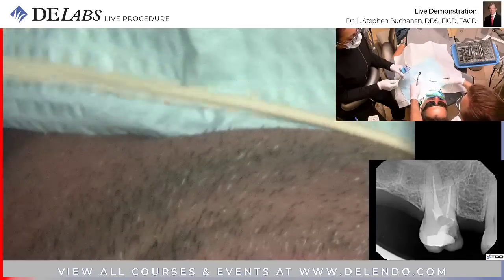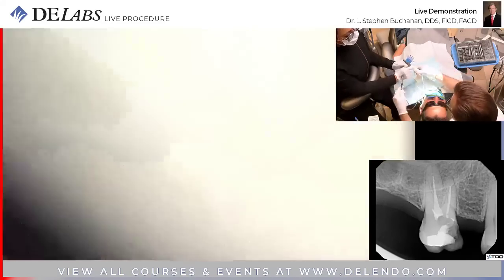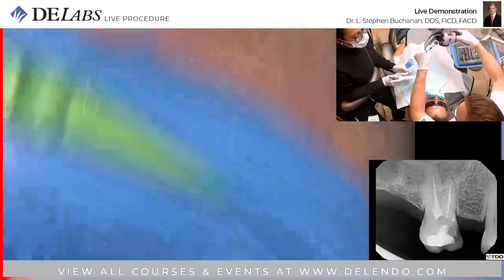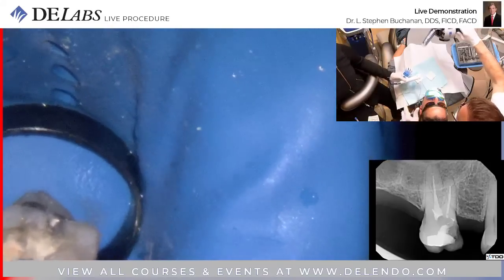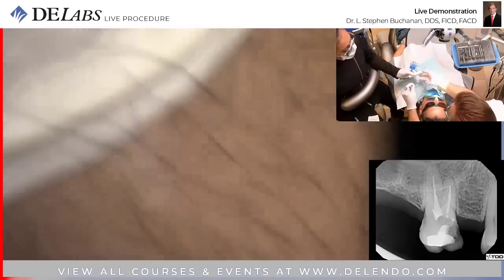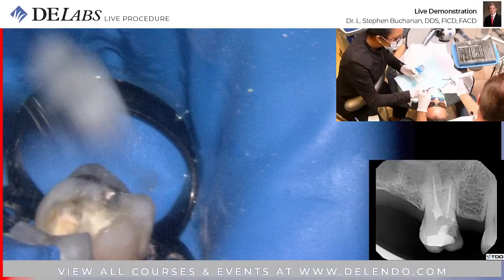We have a 1506 Vortex Blue set at our estimated 19 millimeters. You can also use a hand probe if you need to. I hope this thing is programmed correctly.